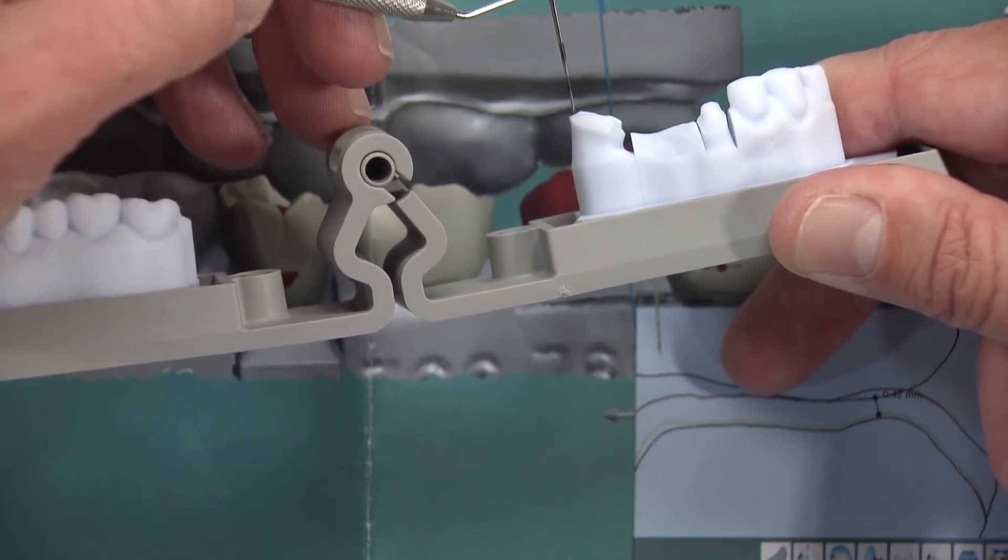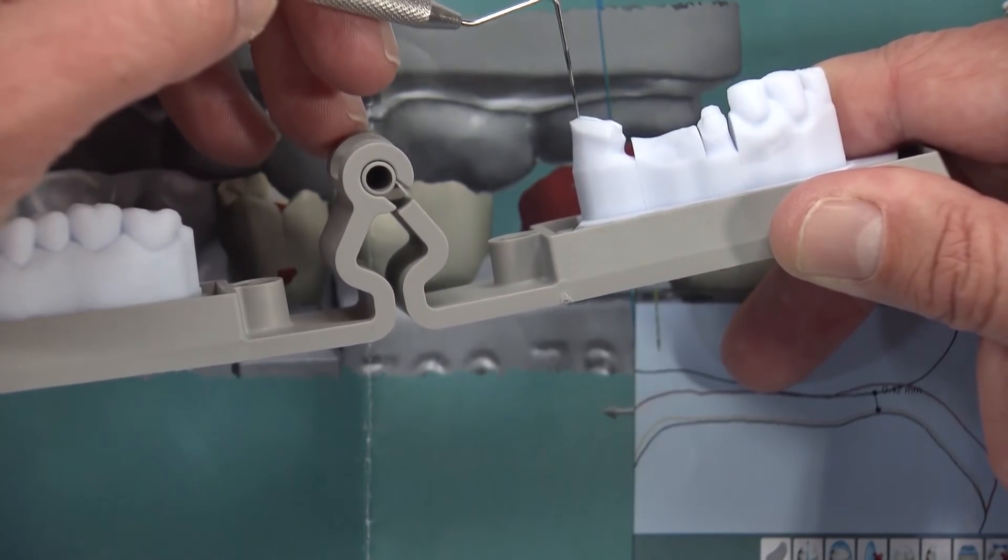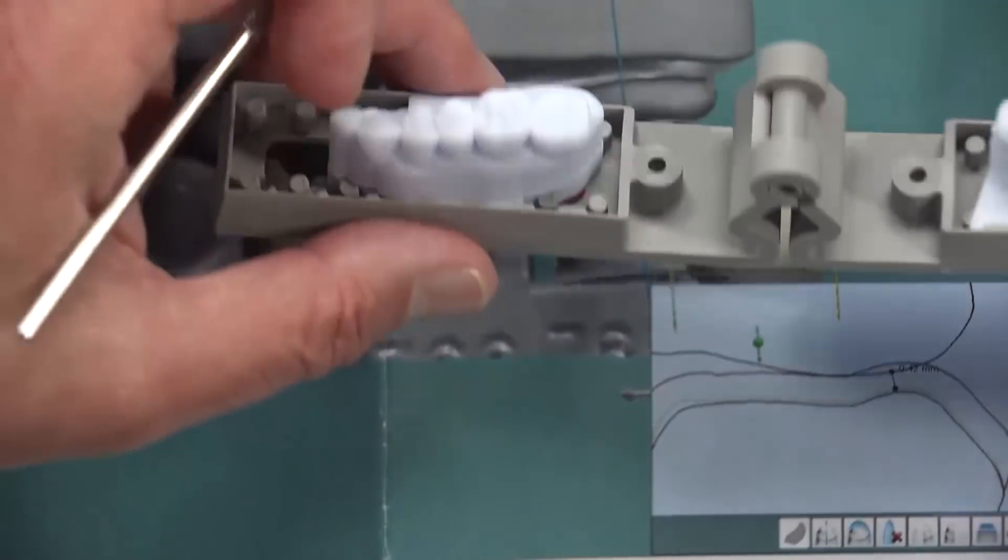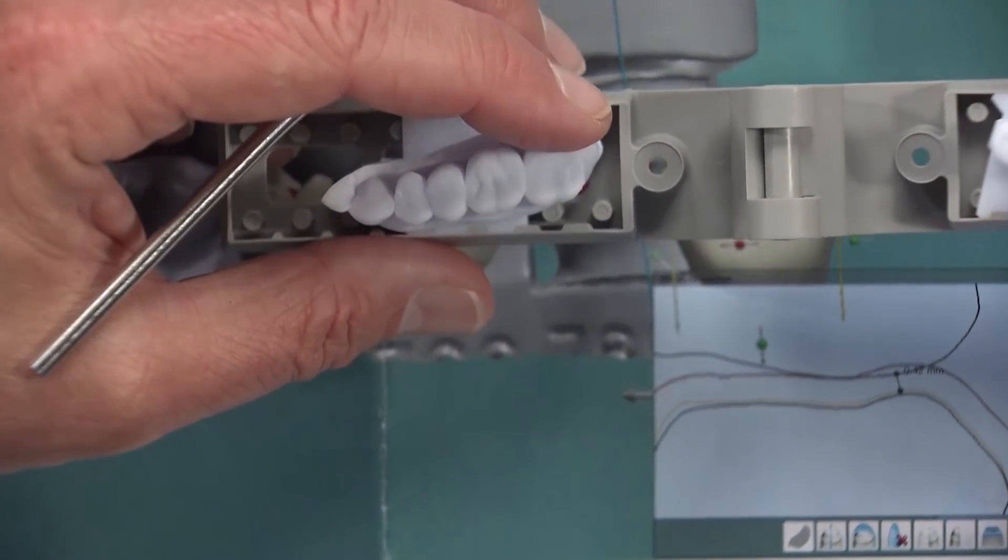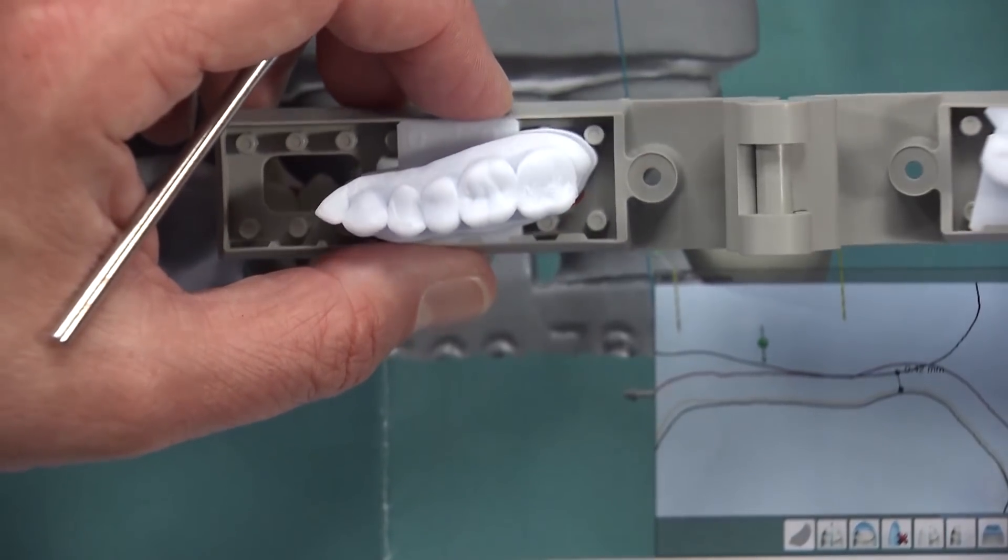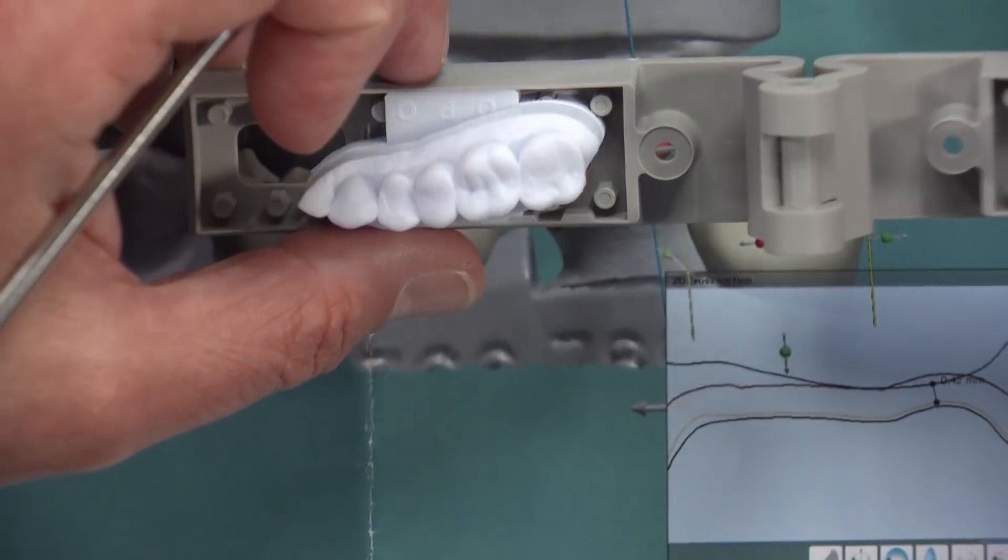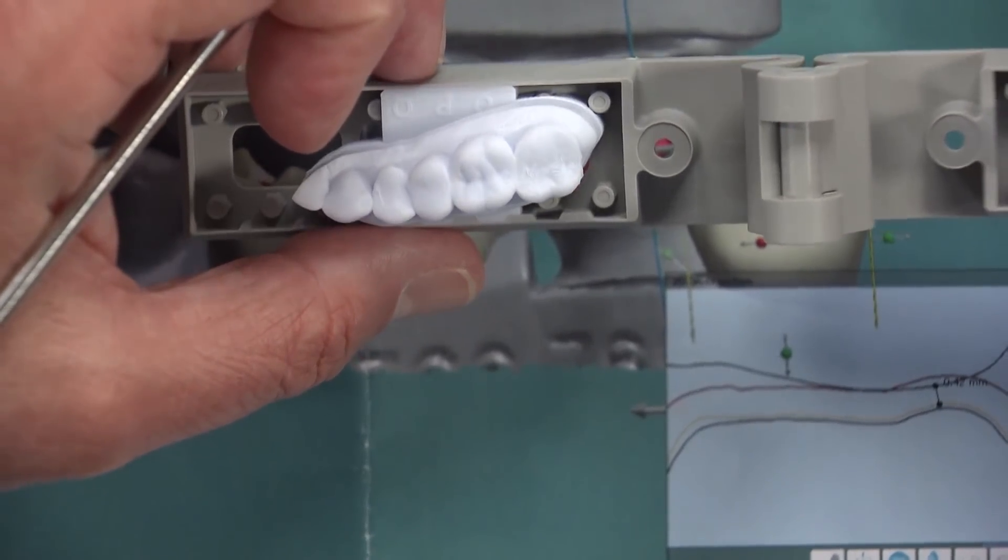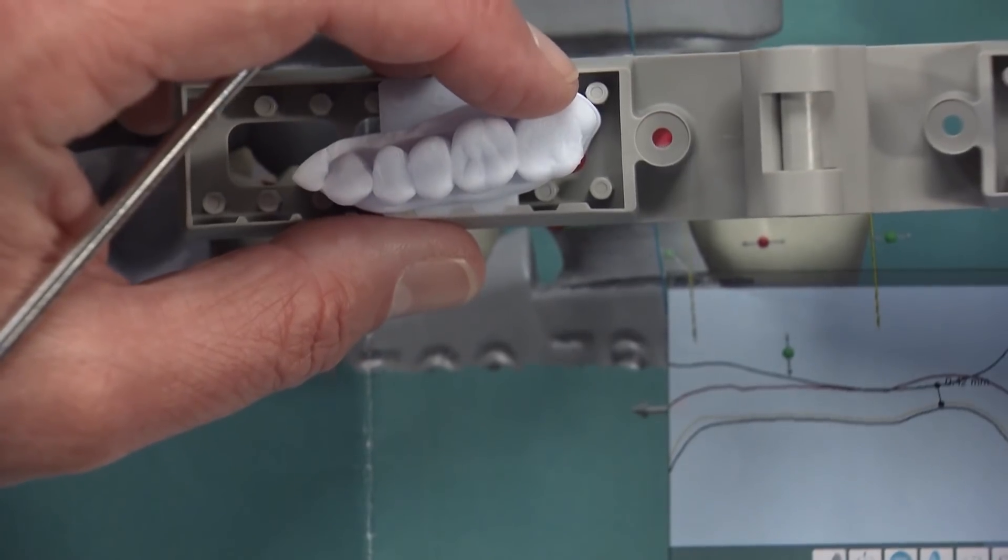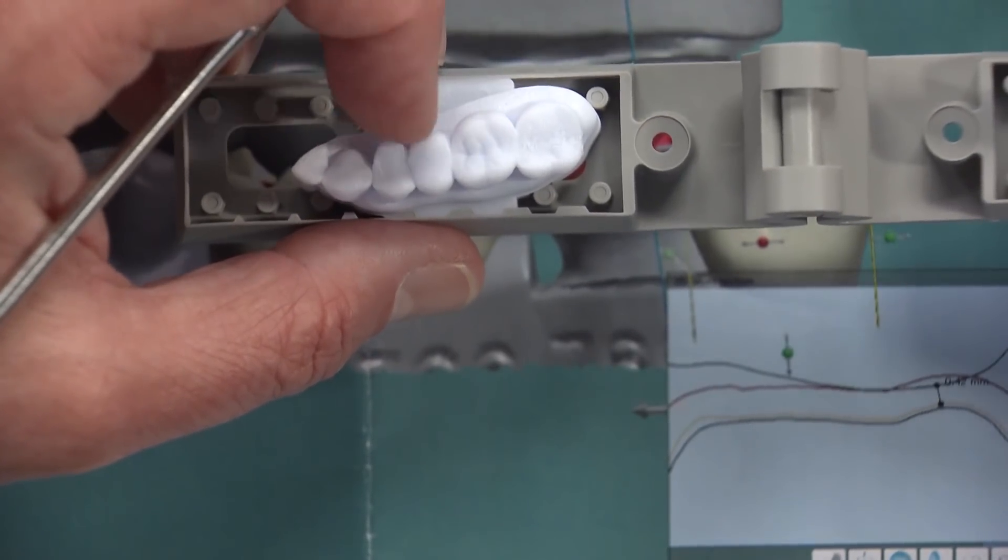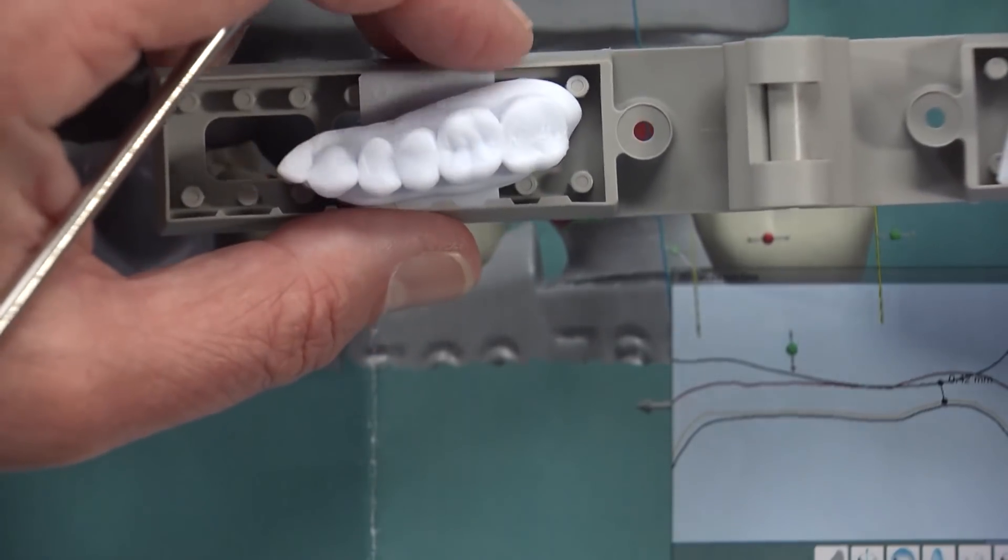The other way to create some more room here for a zirconia bridge would be to adjust the opposing. But you can see this crown, this second molar, looks like it's already been adjusted and adjusted and then adjusted a little bit more compared to the crown in front of it. So this appears to be something that's already been ground on a lot. Maybe that happened during this prep or maybe it happened before, but it looks like we probably don't want to do much more adjustment on that crown.